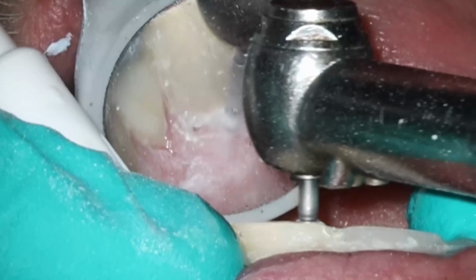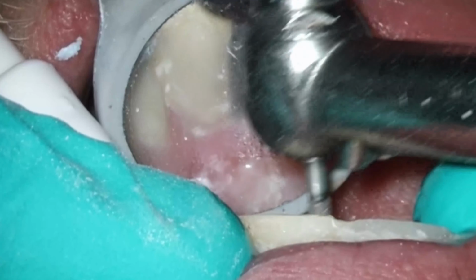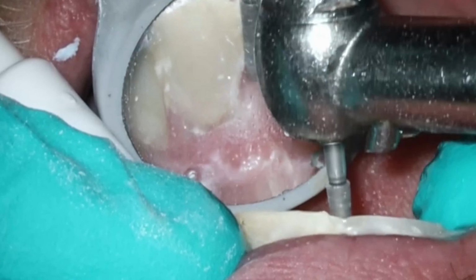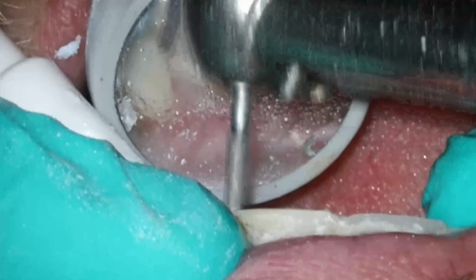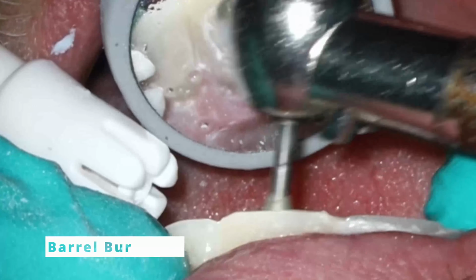I was going to be doing the post in here anyway for this dentist, so may as well give him something that looks really pretty and nice. One thing to mention is if you are going to be sending him back for a crown, you want to make sure those margins are nice and smooth so the gingiva is healthy. Makes it very easy for the dentist then.